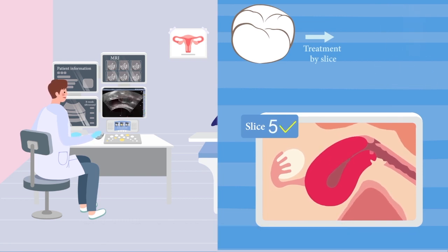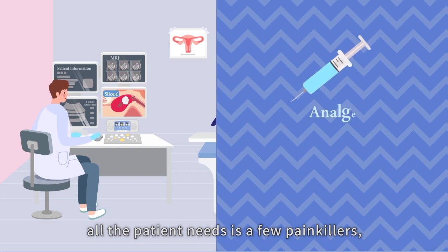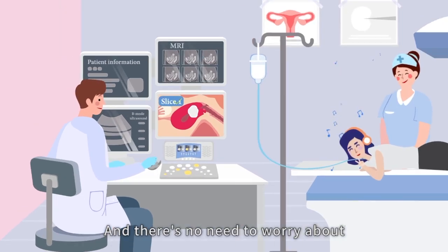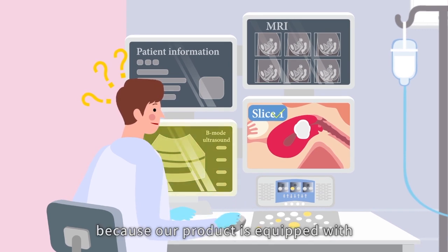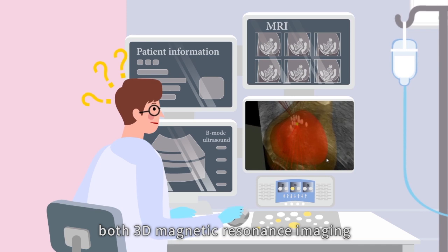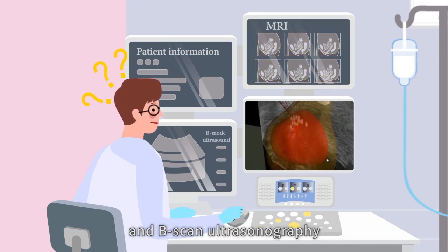Now that the fibroid has been killed, all the patient needs is a few painkillers as well as some music and movies. There's no need to worry about imaging, because our product is equipped with both 3D magnetic resonance imaging and B-scan ultrasonography to achieve precise positioning and treatment.